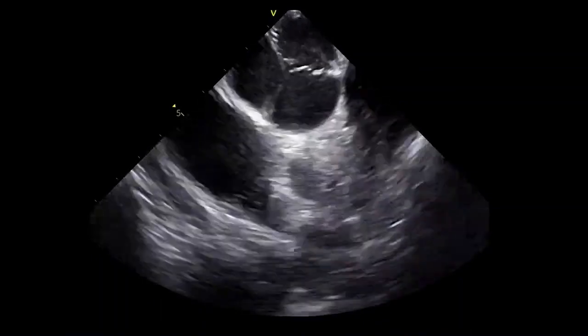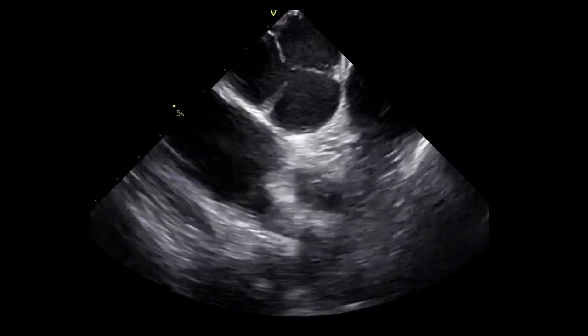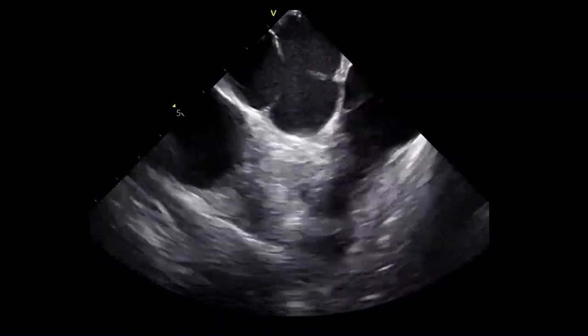This is an important view as it enables visualization of the ridge between the left-sided veins and the left atrial appendage. Proper positioning of the ablation catheter with respect to the ridge is important for successful ablation.